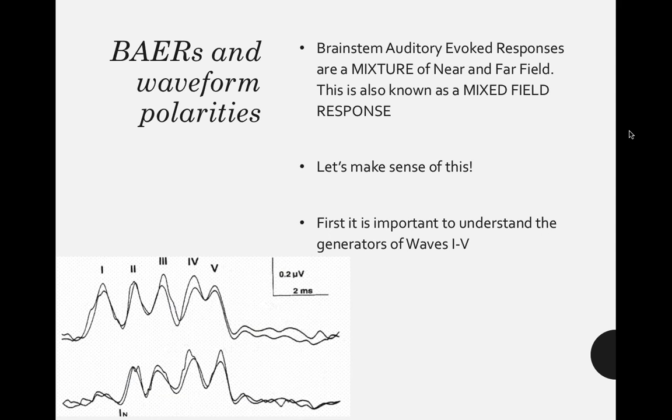And so this is called a mixed field response. And we have to make sense of this. This might seem a little confusing and complicated, but if you remember all the way back to that little square with the positives and minuses and the arrows going up and down, indicating our waveform deflections, this is going to make a lot more sense.